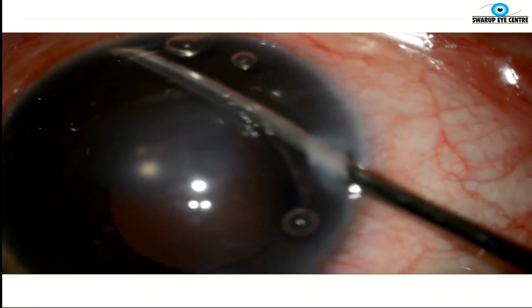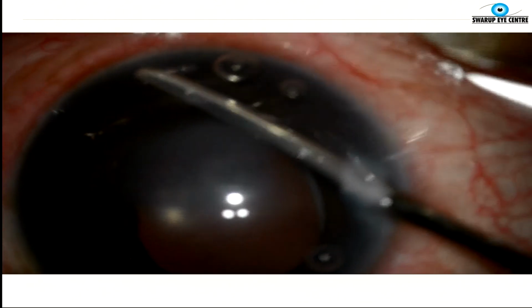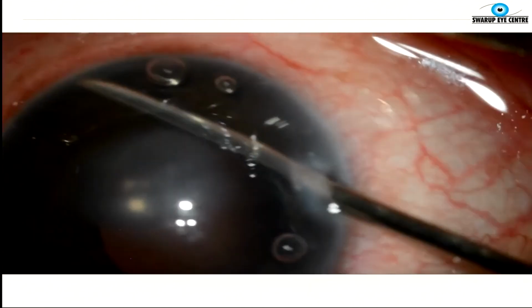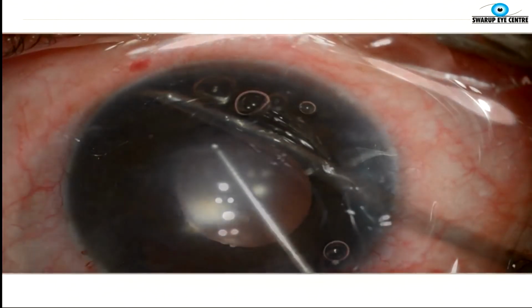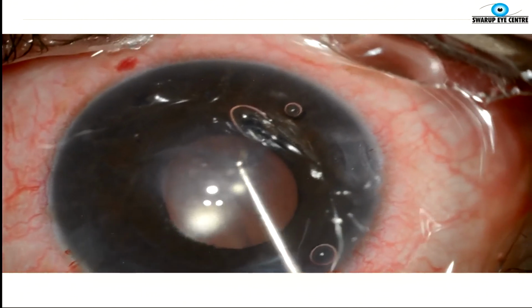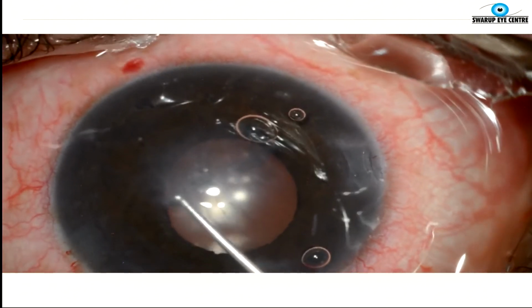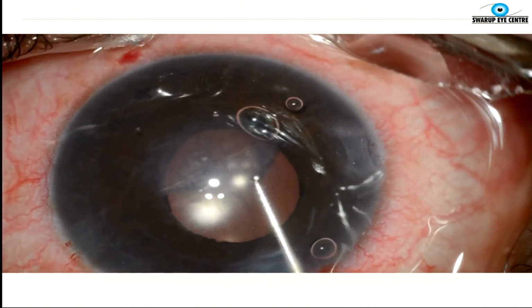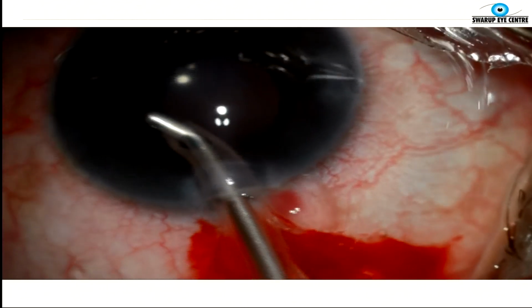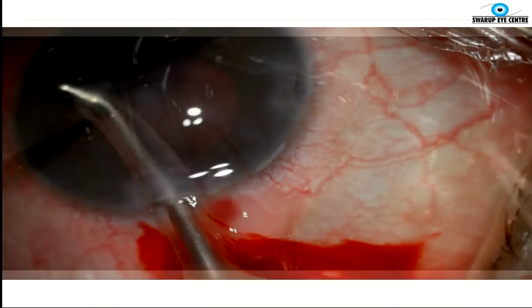So that's what you do when you're in the recipient. It's a good idea to have an inferior PI. You can do a YAG peripheral iridotomy preoperatively, or intraoperatively, you can create a small iridectomy. Then you strip the Descemet membrane. You can do it under air or under a cohesive viscoelastic like so, just like we do for DSAEK. It's a good idea to mark 8 mm on the anterior surface and then do this. And then aspirate the viscoelastic. You can do this surgery through a clear incision or a scleral tunnel, whatever you prefer.